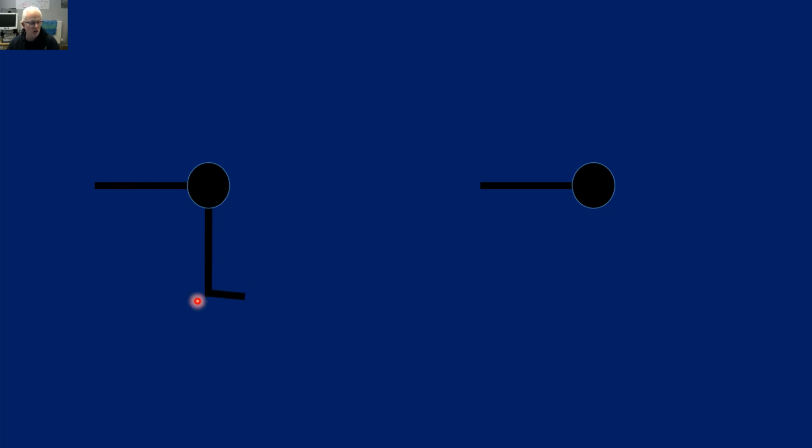So this is kind of a participant, like we saw in the video, sat on the dynamometer. Now what we've gone from is a position of flexion to a position of extension. So the limb has gone from around about a 90-degree knee angle to almost horizontal in this range of motion.